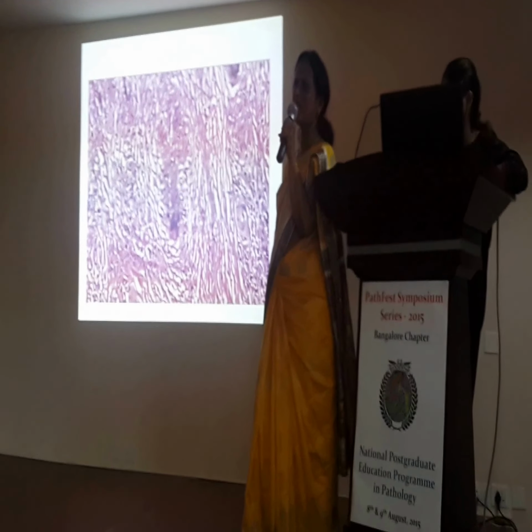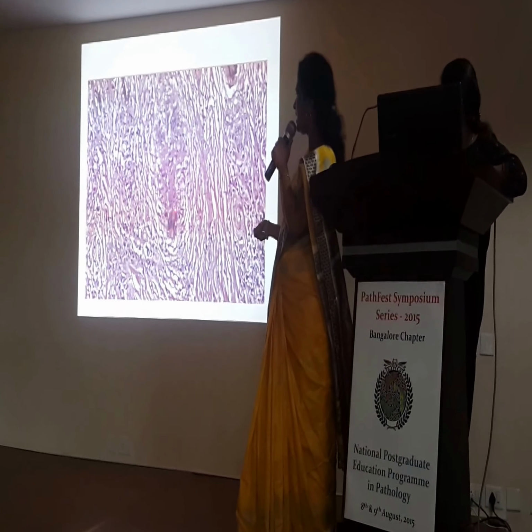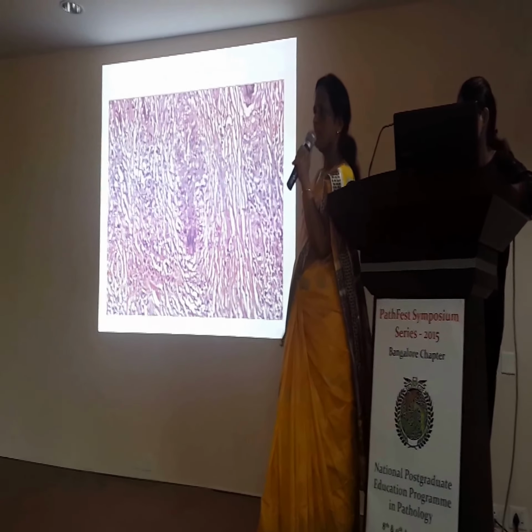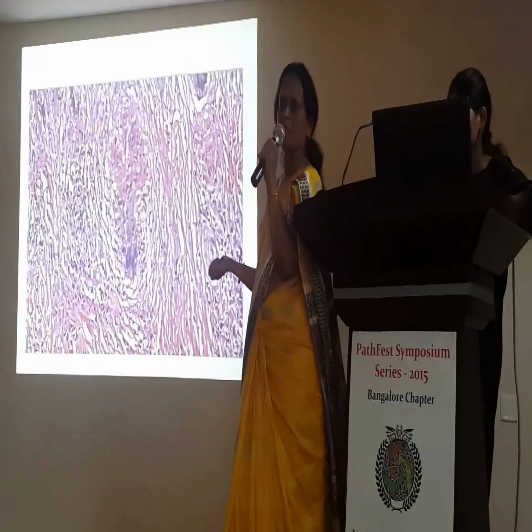And so many giant cells, foreign body. There has to be something, and we just sat and saw. Can you make out that these giant cells have that fungi? This looks like hyalohyphomycosis. It was not pigmented. So one of the variants of phaeohyphomycosis is hyalo, if it is not pigmented.